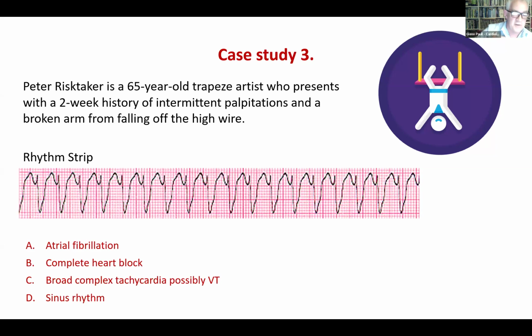So you track down the intercostal spaces, the fourth intercostal space, either side of the sternum, mid-clavicular, but you just want them to not be too far apart. If you find that in order to get under the breast you're having to move V4 about 30 centimetres, or V3, if you can do something else, that's good. But everyone's going to understand if it's difficult anatomy, you just do your best. So have it anatomically correct: where that electrode is, you're trying to have it as close to where it should be as possible, whether that's on top of the breast or below the breast, whichever you can do. And as I said, if 3 people had a go, they might have 3 different interpretations. But you just do your best.